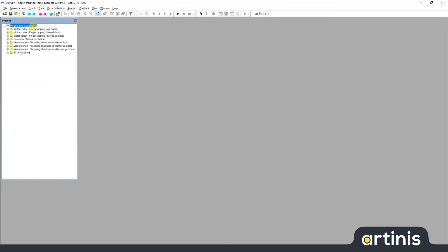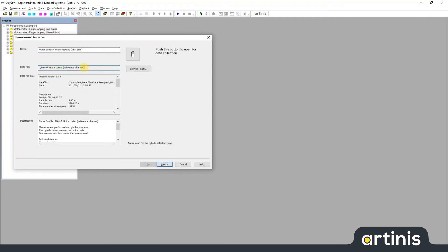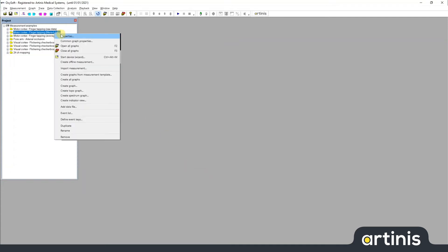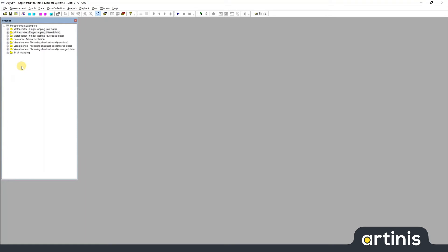This displays quite well the fact that you can have a few underlying data files, but you can make as many measurements as you want based on these data files. Basically the measurements that you see here are just references to the underlying data files. I will show you this by opening the properties for this first one. You can see that this refers to the motor cortex measurement. If I open the second one, this also refers to the same file, and this is no problem at all — it will just both read the same data.